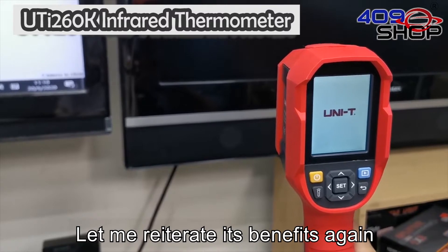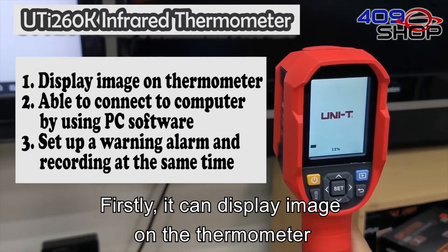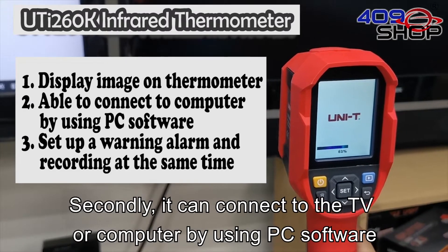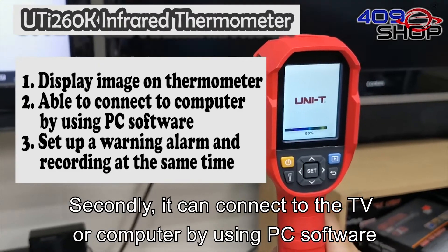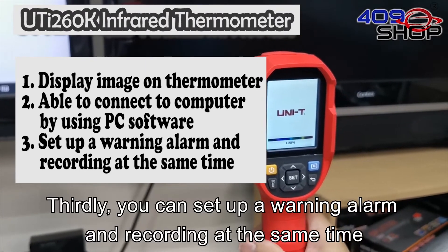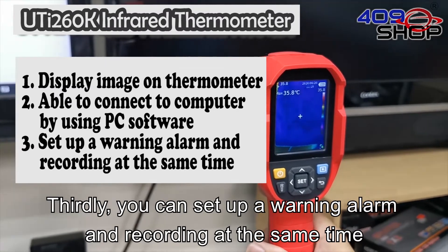Let me reiterate its benefits again. Firstly, it can display an image on the thermometer screen. Secondly, it can connect to the TV or computer by using PC software. Thirdly, you can set up a warning alarm and recording at the same time.